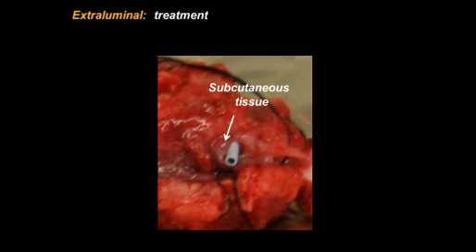So we removed the skin, and we also did cultures of the skin throughout the study as well. Removing the skin, you now see the subcutaneous tissue, and you see that it is somewhat of a pearly white material. This is actually a collection over time of fibrin, granulation tissue, and collagen and connective tissue. This is normal in appearance.